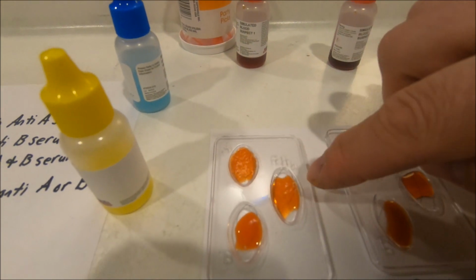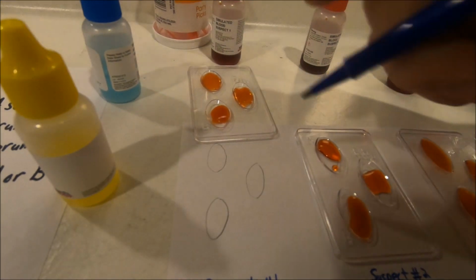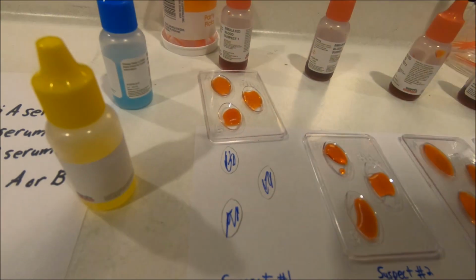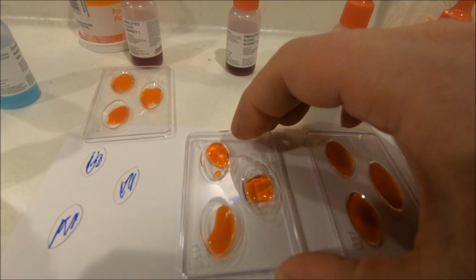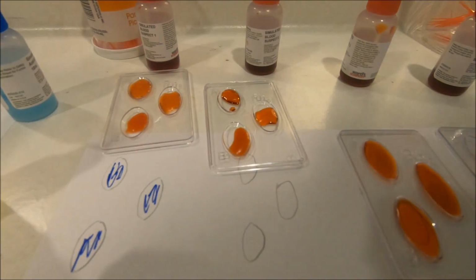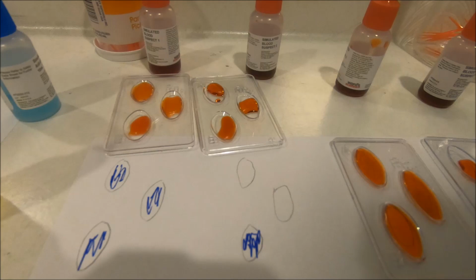Suspect 1, it's a little bit difficult to see, but there's clotting, floaties, chunks in all 3 of the samples. So for suspect 1, we're going to shade in all 3, saying that clotting occurred in all 3. Suspect 2, we can see that the A is clear, the RH is clear, but down in the B we've got clotting occurring, so the only one we will shade is the B spot.